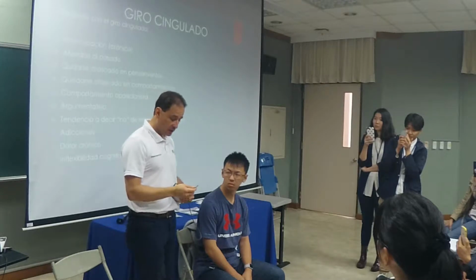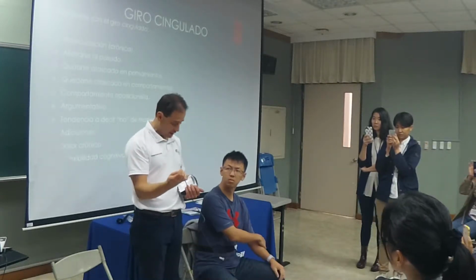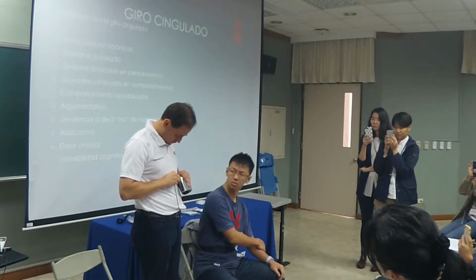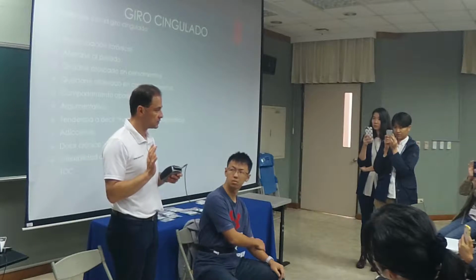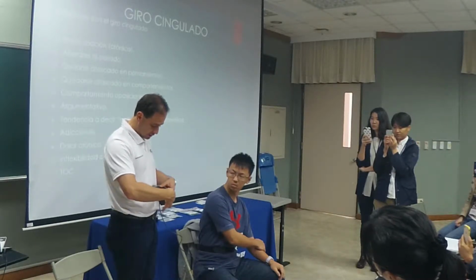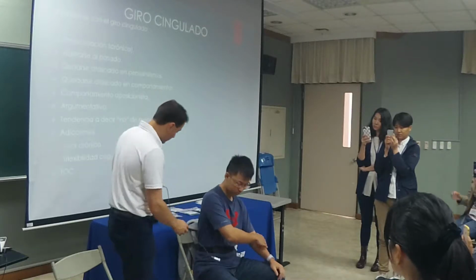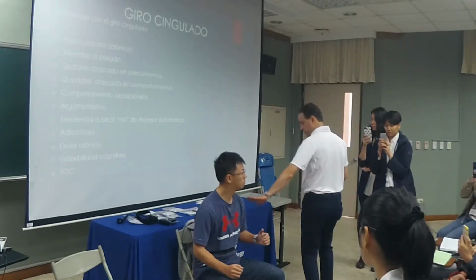Now, if you notice, the cable has a red dot, and the amplifier has a red dot. So what you do is match the red dot with the red dot, and you don't have to force it. It goes in nicely. And what I like about this system is the extra protection that the cables have to avoid noise. It's very good. So I go like this, and actually, I'm going to use this table, just play like this.